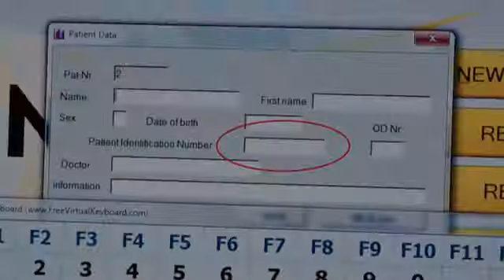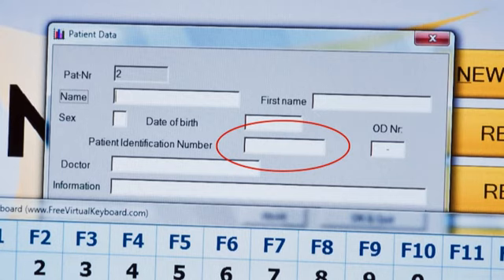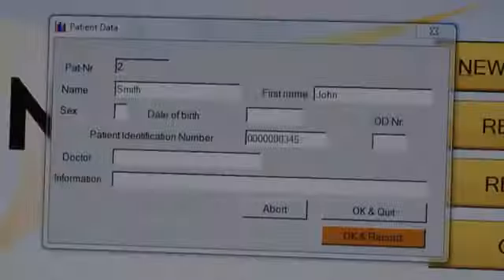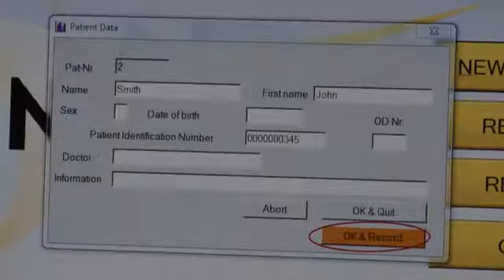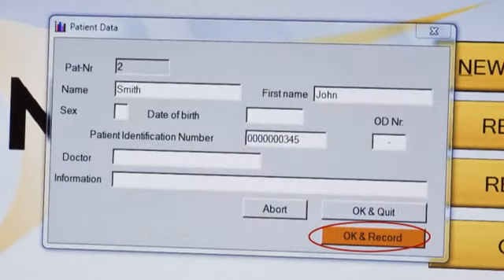The minimum information required is the patient identification number. Enter the patient details and click OK to begin.